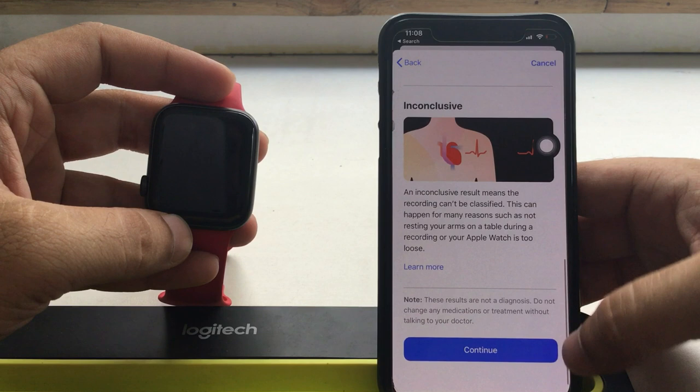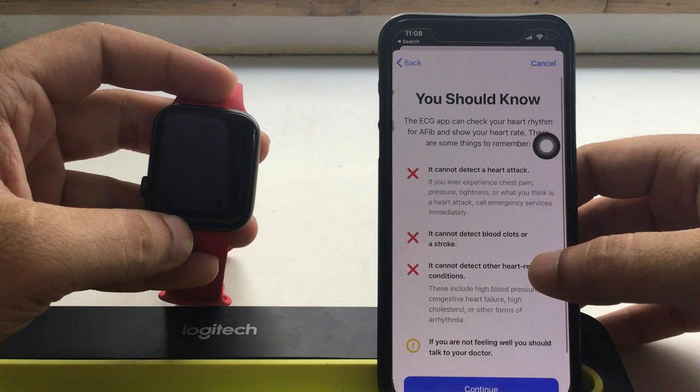Also get the information about things to remember. This cannot detect a heart attack, cannot detect blood clots, or cannot detect other heart-related conditions.